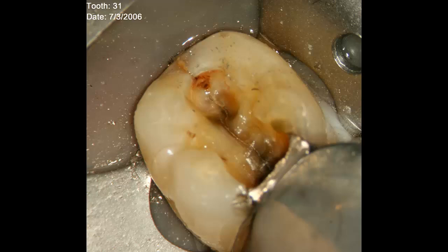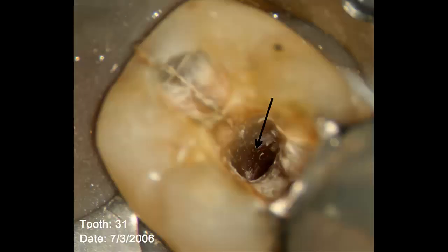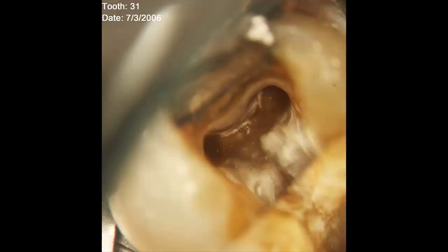Removal of the restoration revealed a crown fracture coursing through the distal marginal ridge. As the initial access was performed, the crack could be traced 1 to 2 millimeters into the distal wall of the distal canal orifice. The dentin was also quite stained with arrested caries that did not stain with caries indicator dye. All root canal systems were cleaned and shaped with direct line access.